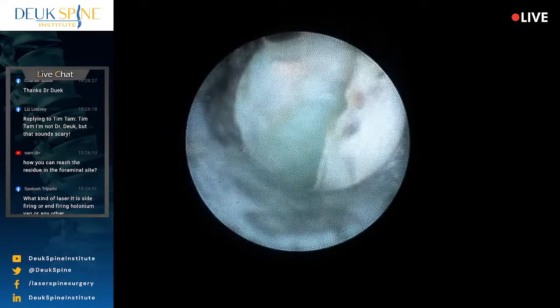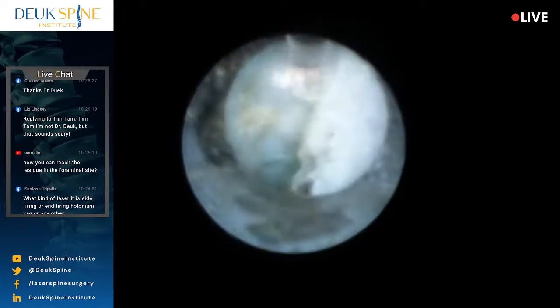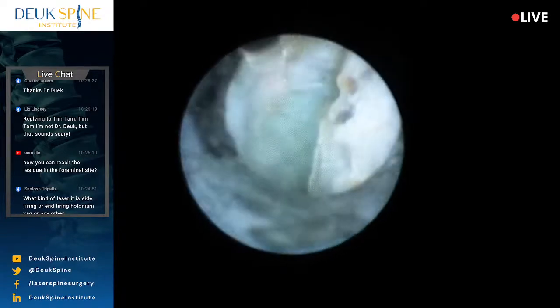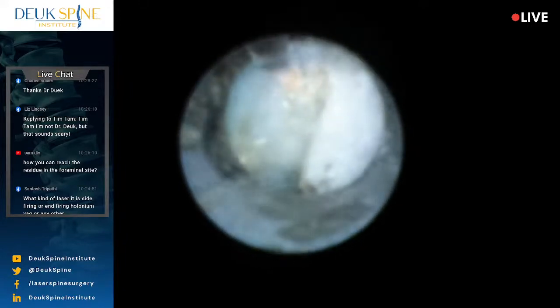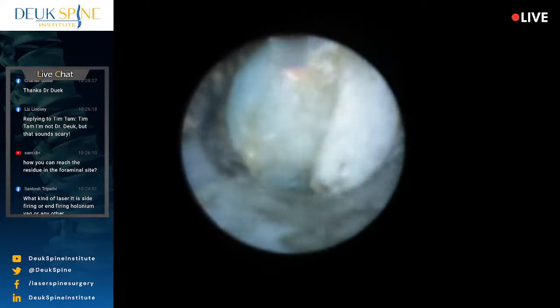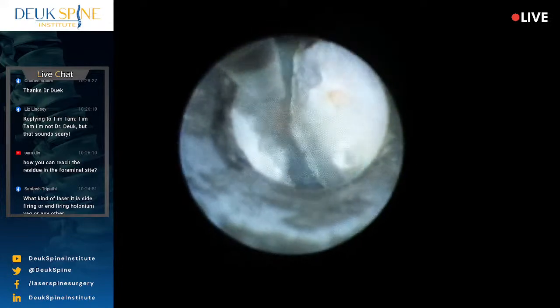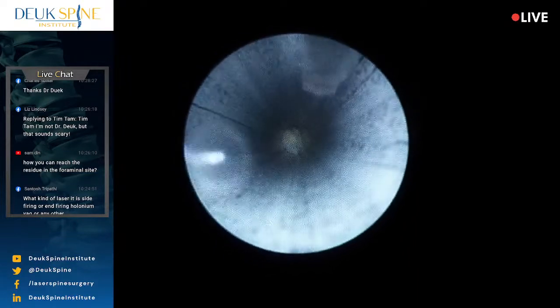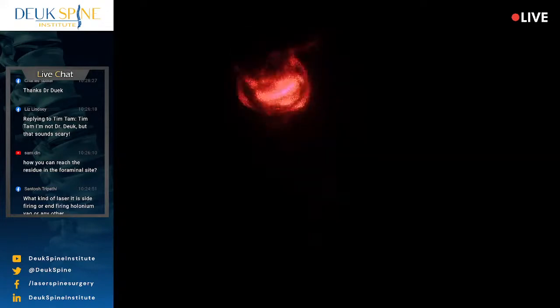And I think I've debrided the annulus because that's only PLL left. There's a little bit more here, but it's mostly scar tissue. See the golden color? That's dystrophic calcification. That golden color is what calcium looks like when it interacts with the laser energy. So this is just scar tissue that's been calcified. Bone spurs, I blasted the ones I needed to, we're done. So this level's done. I still need this patient relaxed for another 10 minutes, and then we can start getting them reversed.